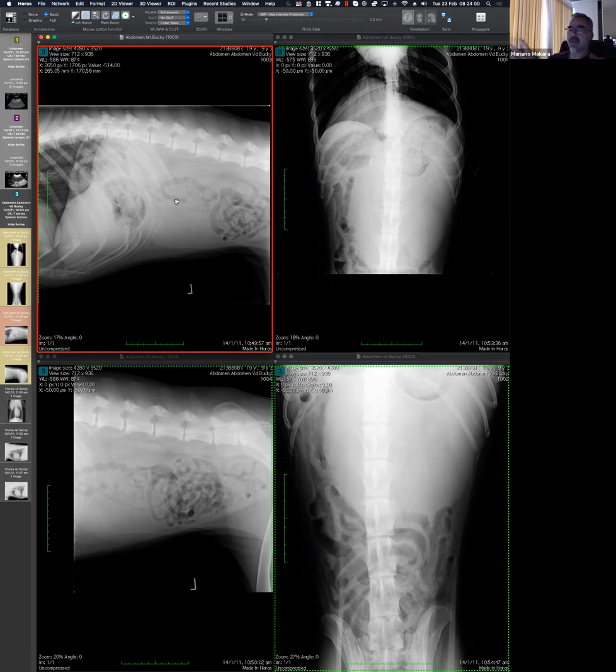So it could be a mass, and I suppose within mass you include things like a hematoma, primary neoplasia, granuloma, whatever, those differentials. That's extremely hard to differentiate, even if we do ultrasound or whatever modality we run. That question is going to be extremely hard to answer.